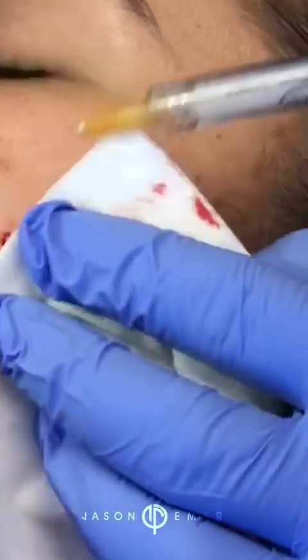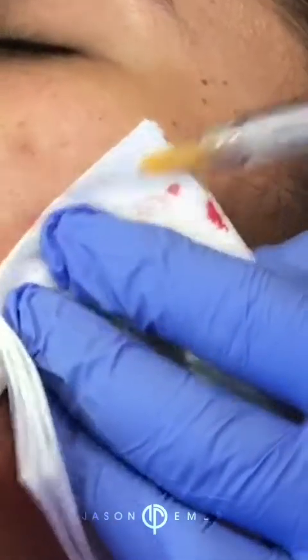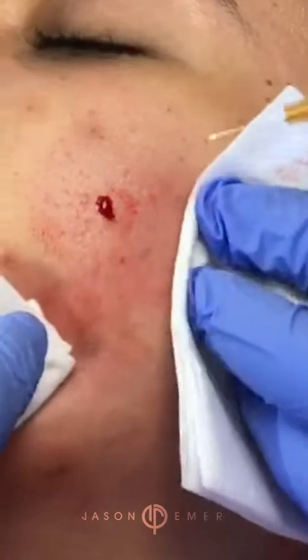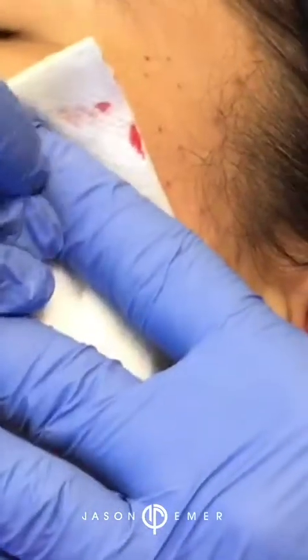We're going right underneath those scars. The Bellafill needle is a little bigger, so I'm doing this as gently as I can. I'm sorry if I'm hurting you, I'm trying not to. That's fine. You're doing great. We did a little bit of numbing. Good. Okay, so what we're going to do now, let that settle down. Hold with your left hand and the ice. Yeah, that's good. Turn to the left. Now we're going to go to this side.